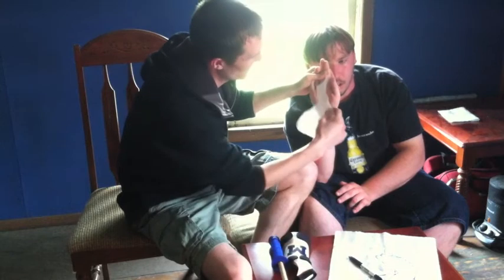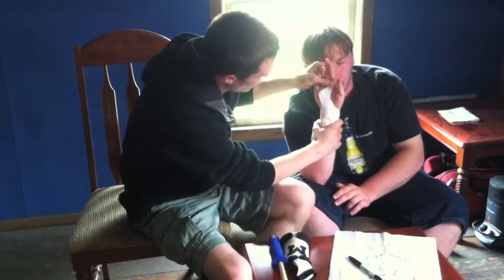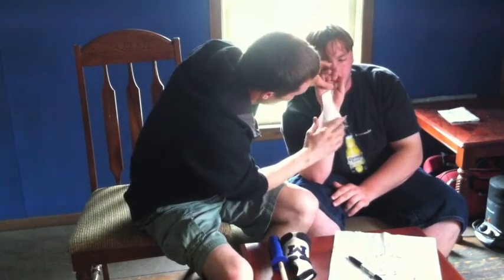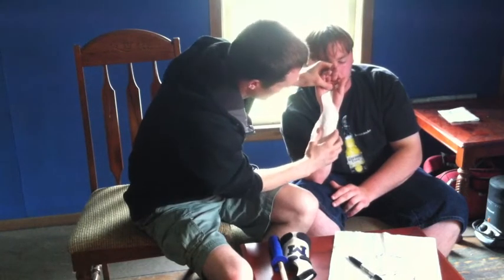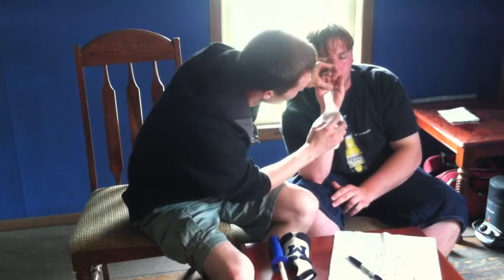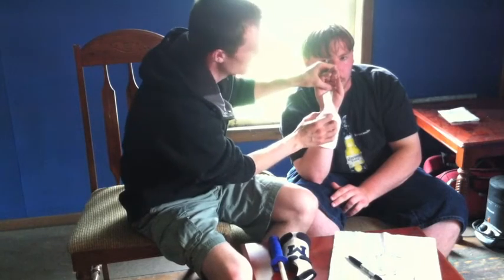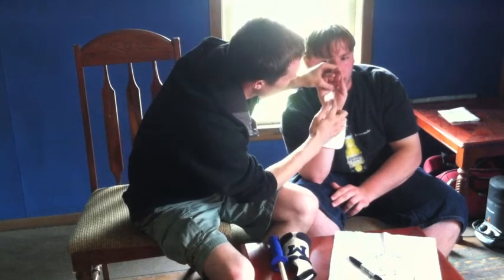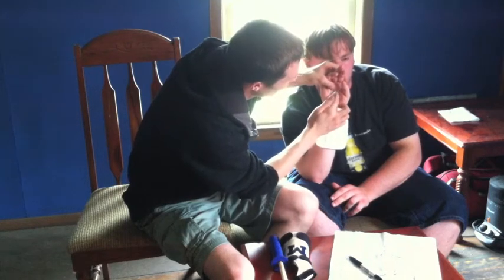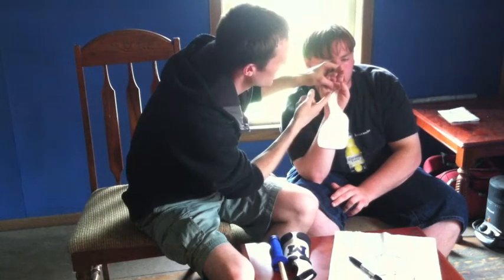So if I put this in here and wrap it around here, we can see that it folds up on the anterior portion of the forearm, that we're steering clear of that CMC joint right here, and also the styloid process on the ulna right here. And then this portion right here actually fits right inside the thenar crease, so that the thenar crease is exposed, and also the distal palmar crease right here.